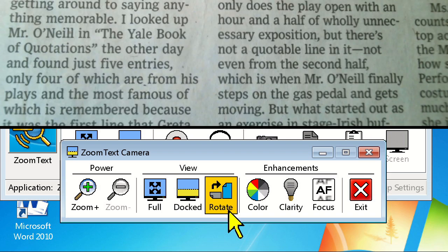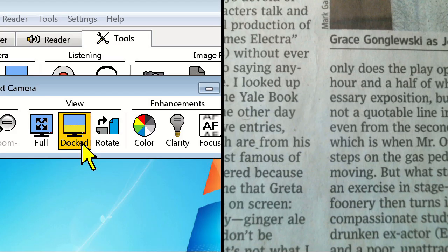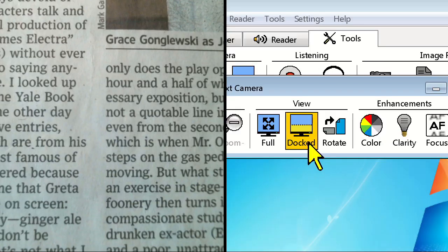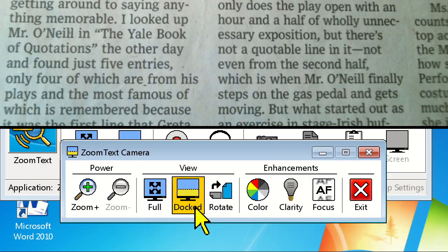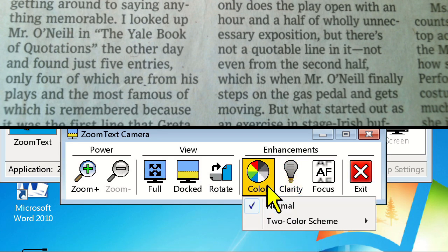Pressing the Dock button will allow you to move the camera image to the top, right, bottom, or left-hand side of the screen. The next and most powerful part of the camera feature are the enhancements.